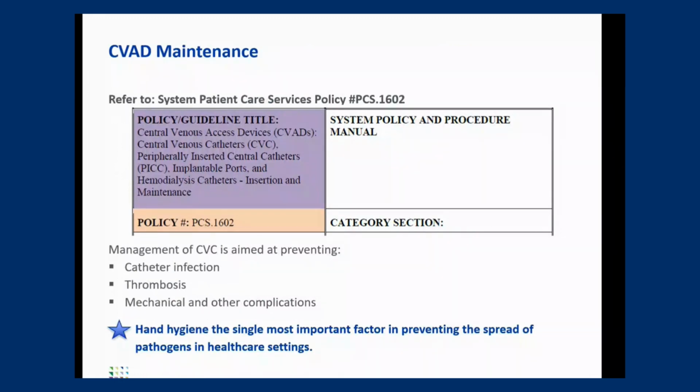This is our system policy on central line maintenance. And of course, the one most important thing that you can do to help prevent infection is hand washing.